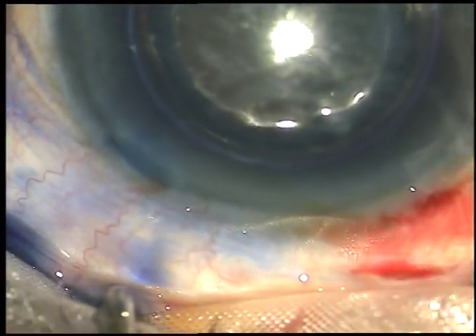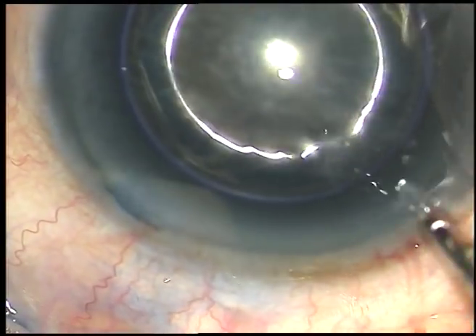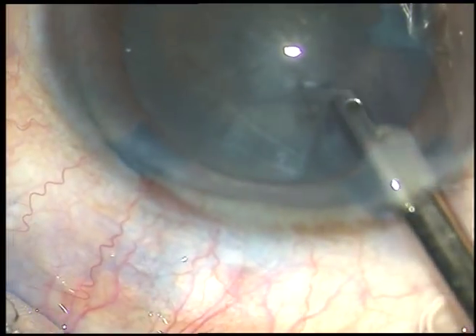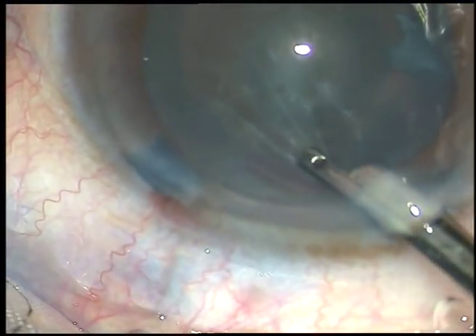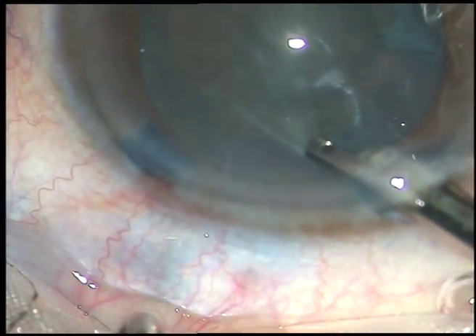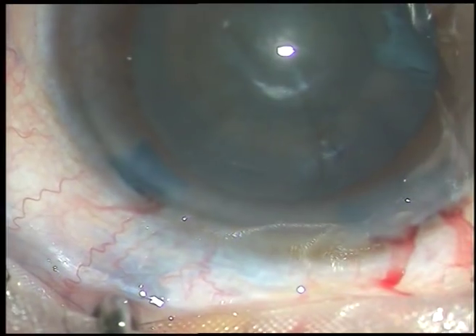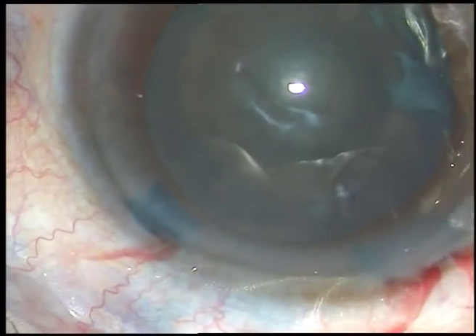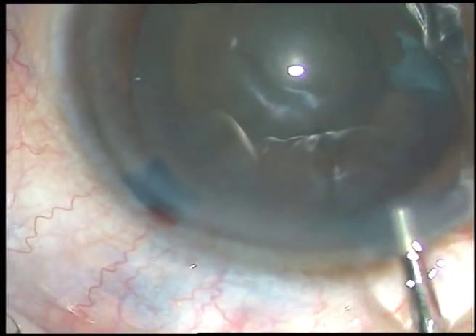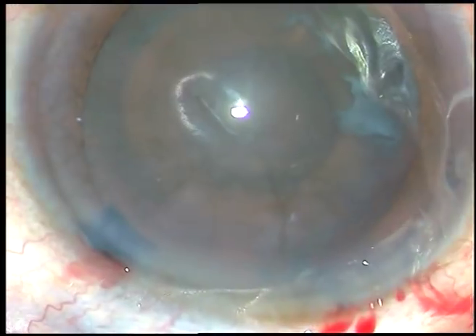By this time I have made the incisions and to do a capsulorexis very nicely, I have stained the capsule with trypan blue dye. Now the dye is washed out using a 23-gauge Simcoe cannula. Then I inject viscoelastic substance — HPMC, that is hydroxypropyl methylcellulose 2%. Now is the time to do capsulorexis.